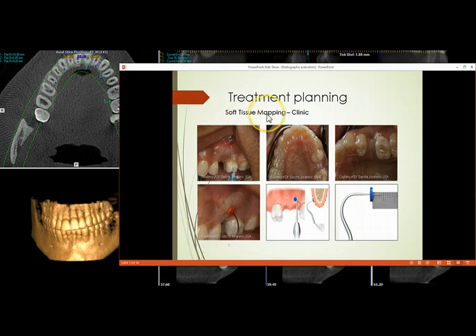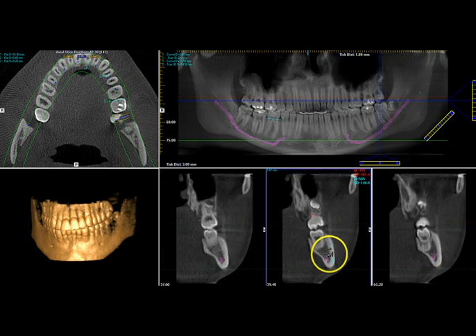And with that, because remember we talked about one of the weaknesses of periapical and PAN, we can use the distortion formula we talked about to get a good height, but it still lacks in the width part. And for CT scan, for example, you can see a nice width, right?